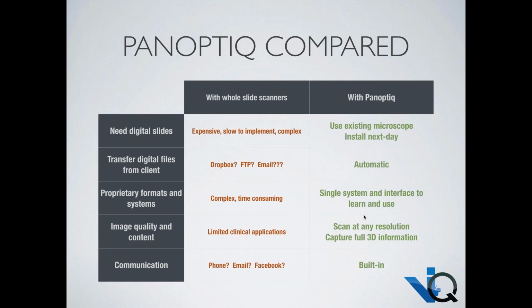Richard, I would add that the Z-stack really is only essential for a peripheral smear case in which you have to focus in and out of a specific cell, but more importantly for cytology slides. I think for the overwhelming majority of anatomic pathology slides, mostly surgical pathology and even peripheral smears and bone marrows, you don't necessarily need Z-stack scanning for a majority of the area of interest. So I think we can use this to limit both the scanning time and the size of the scanned image. Yeah.